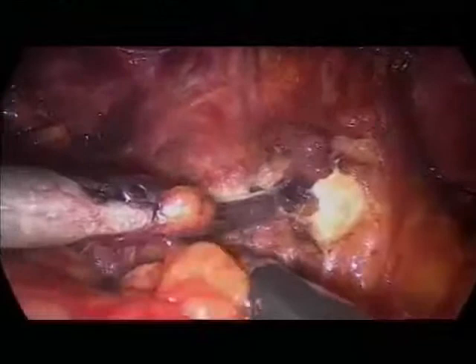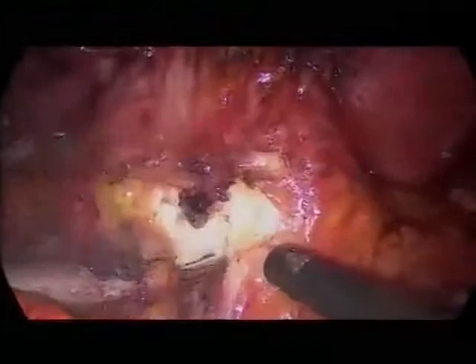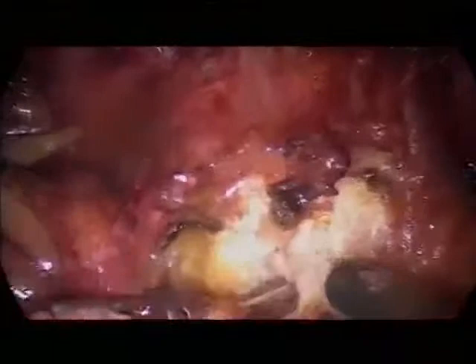In your right hand, do you have a bipolar? In my right hand, this is my right hand here. This is the bipolar. And in the left hand, I have this instrument here. I always perform laparoscopy in that way. Here, the fibers of the bladder neck. We inserted a catheter at the beginning, an 18 French catheter. We don't have any instrument in the rectum.